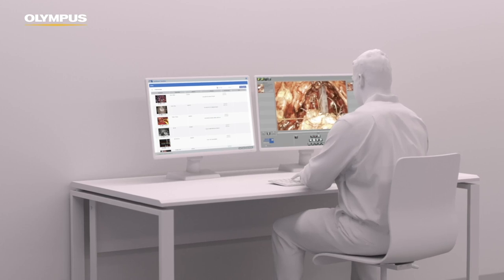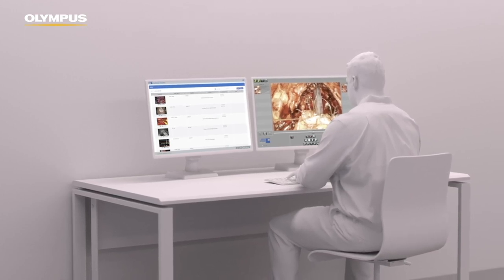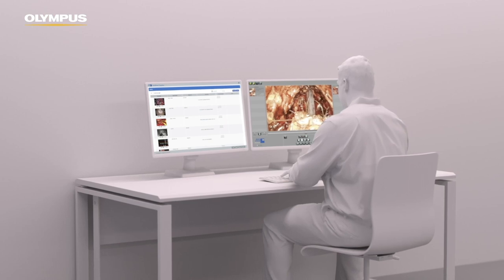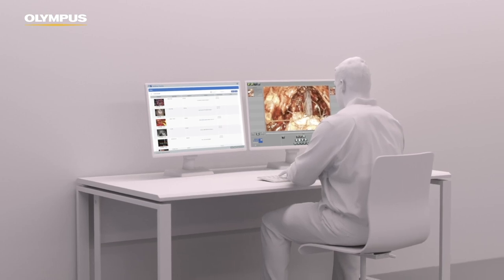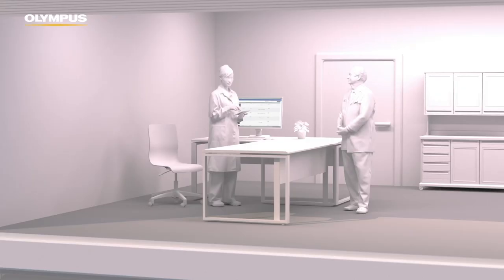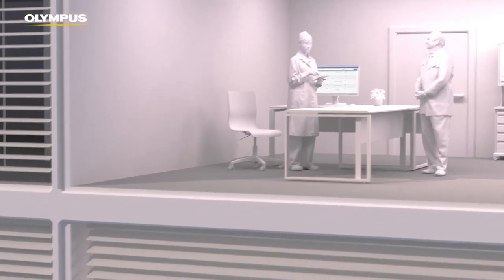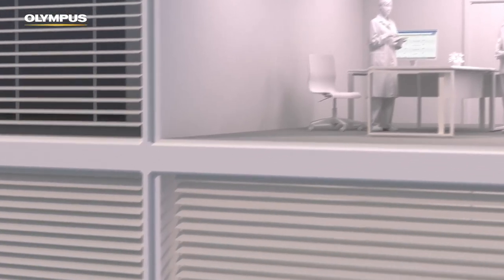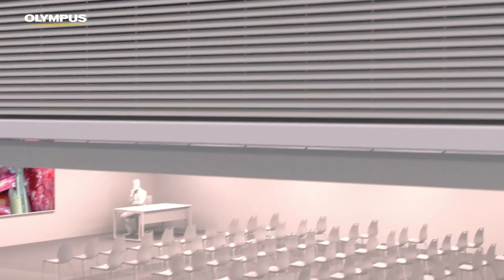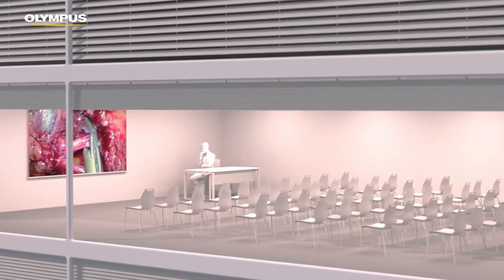Due to an embedded video editing application, clinicians are able to cut and combine videos and create presentation-ready videos in minutes. Anonymized content can be separately stored in a teaching library within Vaultstream and used for learning and presentations at congresses or external events.